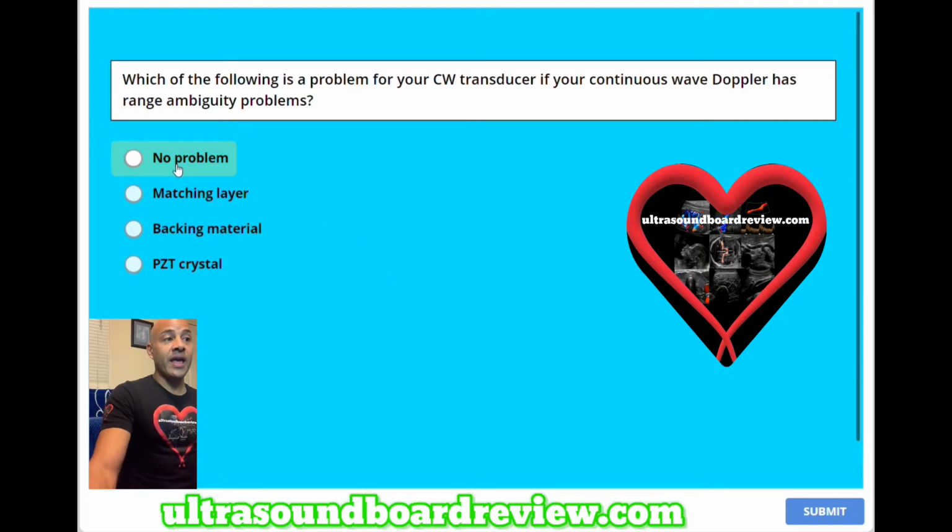The answer is A, no problem, because range ambiguity is a disadvantage of using a continuous wave transducer and has nothing to do with the integrity of the matching layer, backing layer or the PZT crystal. This is just something we as sonographers have to deal with. So for this question, it's not a problem with any of these.